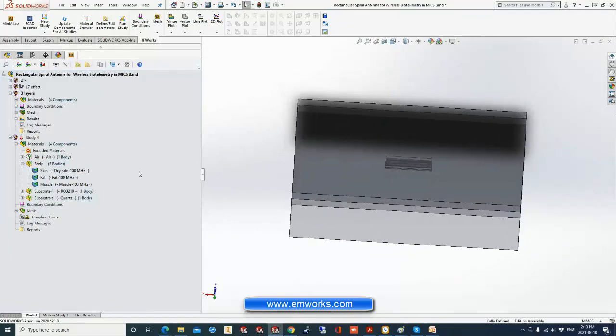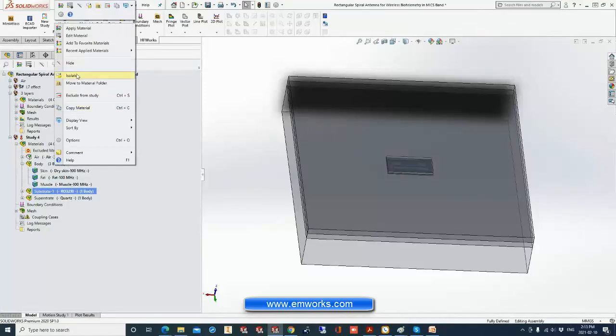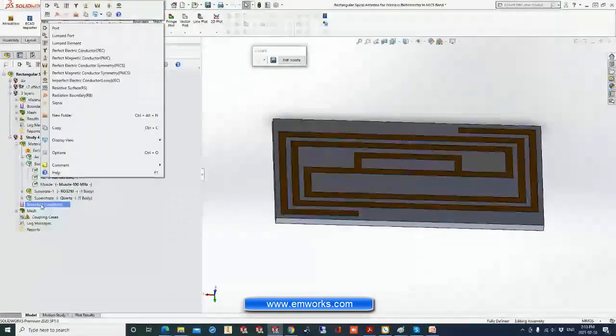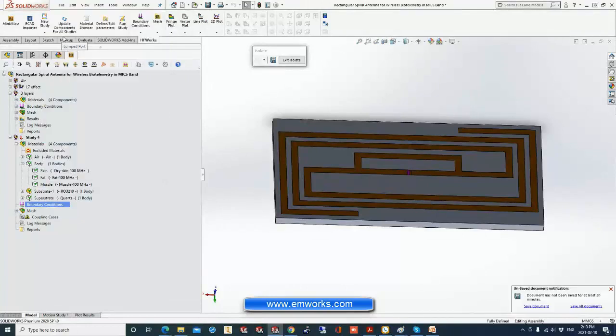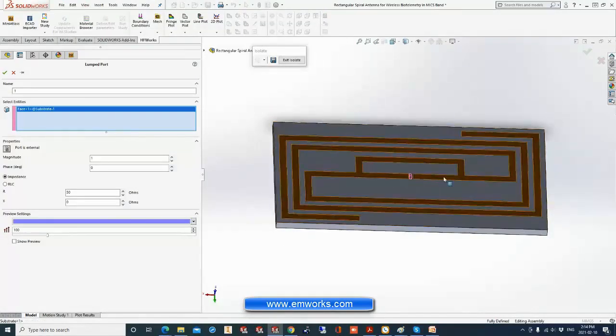As a second step, we have to define two main pieces of information. The first one is the port. It means the feed points of our antenna. So first, let me just isolate my substrate. My feed point, or my port, will be a lumped port, because I know that the impedance of the input port is 50 ohm. To force the impedance, we can define here a lumped port, and we select the entry port here, in between the two traces.